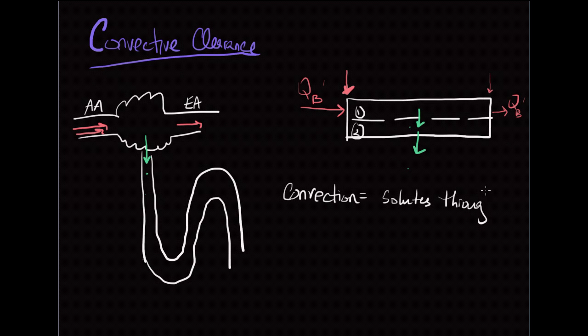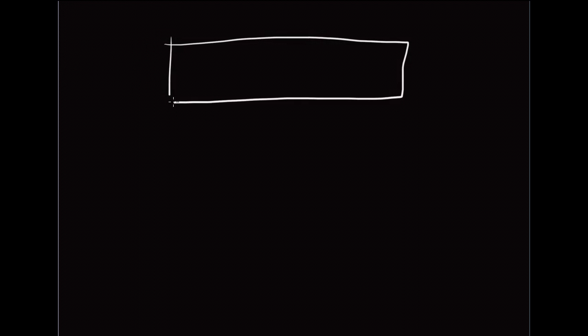And in this case the fluid is the water that you take from the blood. So solutes move along with the water. They're being carried with that ultrafiltrate or water from compartment 1 through the membrane to compartment 2 and then out. So how do solutes move? Now let's look at this a little more closely. Let's look at our filter and then we'll get back to the glomerulus. And here's our membrane. And we said here's compartment 1 and here's compartment 2.